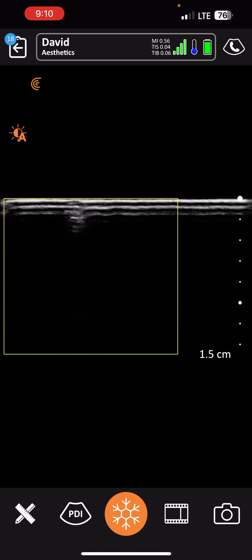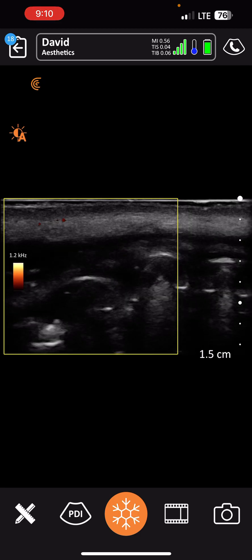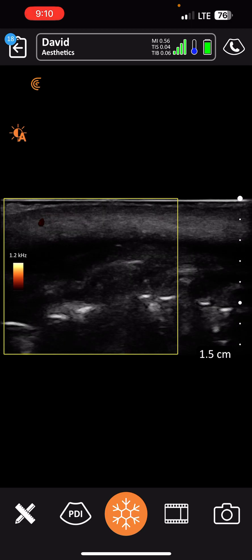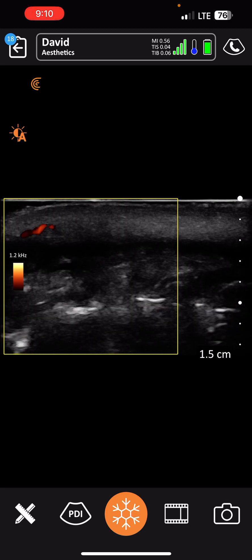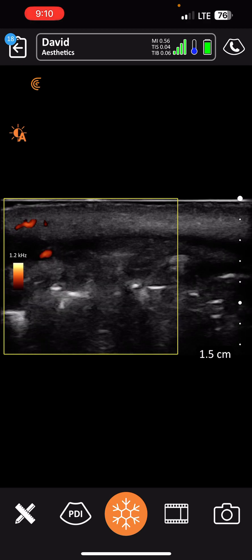We're going to map the inferior and the superior labial artery as well as the facial, so we can track everything. Again, in that inferior labial artery — you can see it's tracking very nicely.